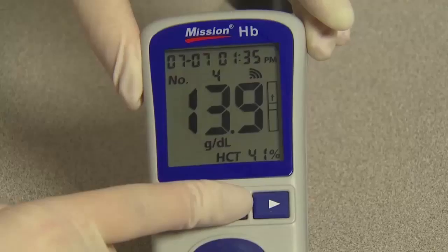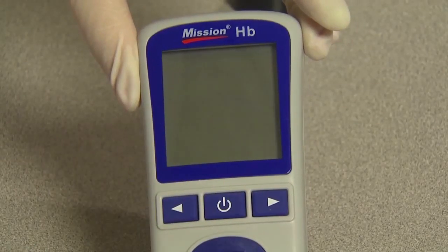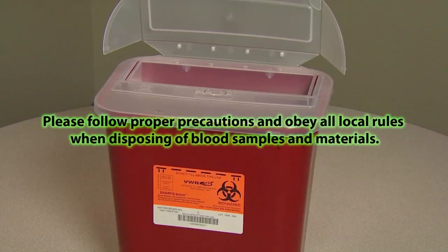The meter will automatically turn off after 8 minutes of inactivity or when the power button is pressed. Please follow proper precautions and obey all local rules when disposing of blood samples and materials.